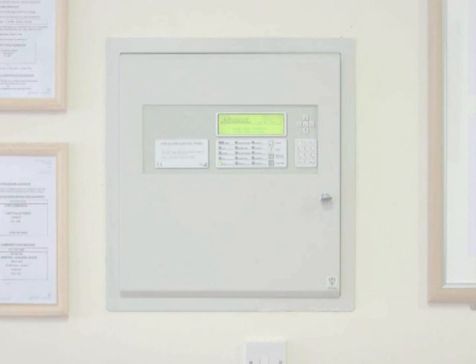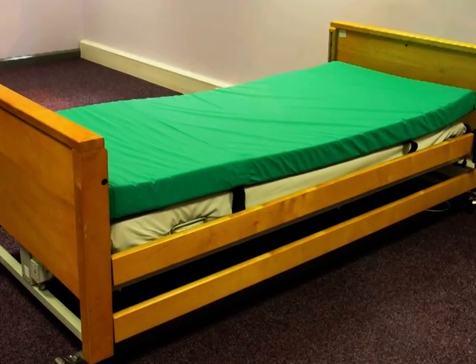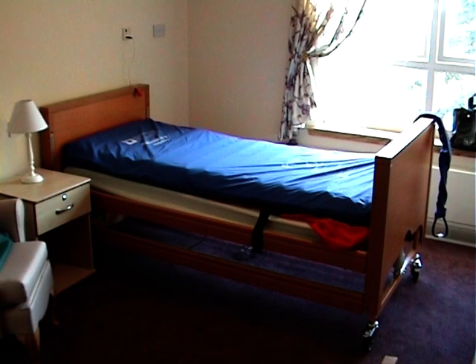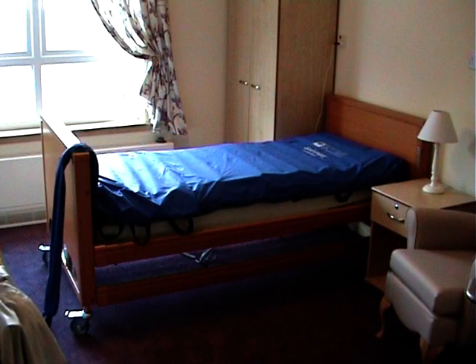The equipment recommended for these high-risk service users are, for the profiler bed, a green evacuation sledge, ProPad. For the airflow mattress, a red parachute type underlay. Note that there are 2 sizes, one to fit an 8-inch mattress and one to fit a 6-inch mattress. There will also be a new product which will be available from SunChoice Europe, an airflow mattress which has an integral evacuation pad built in.